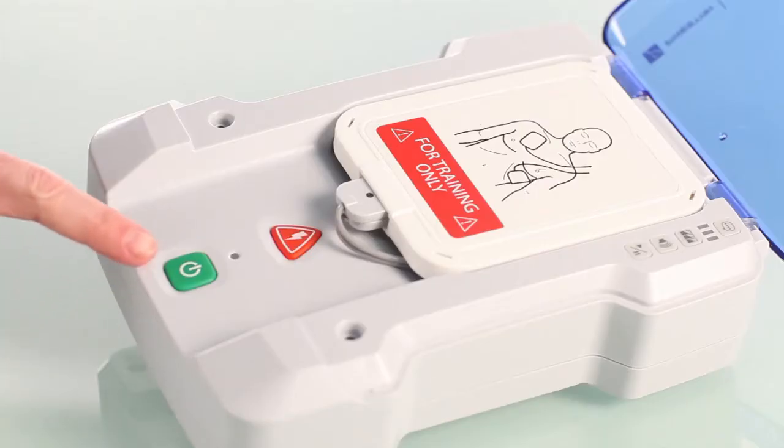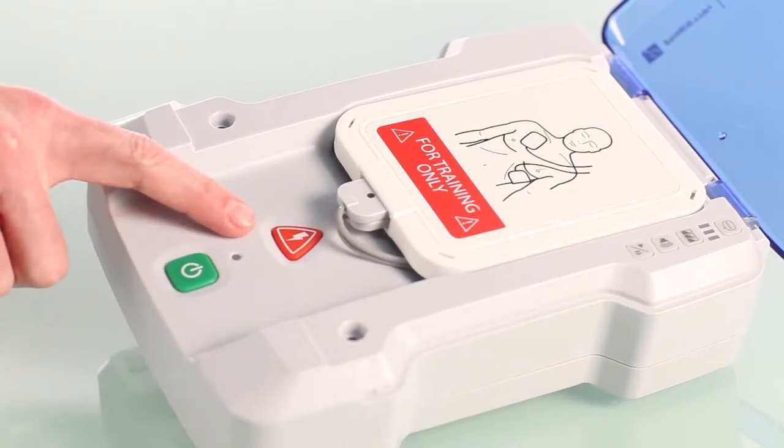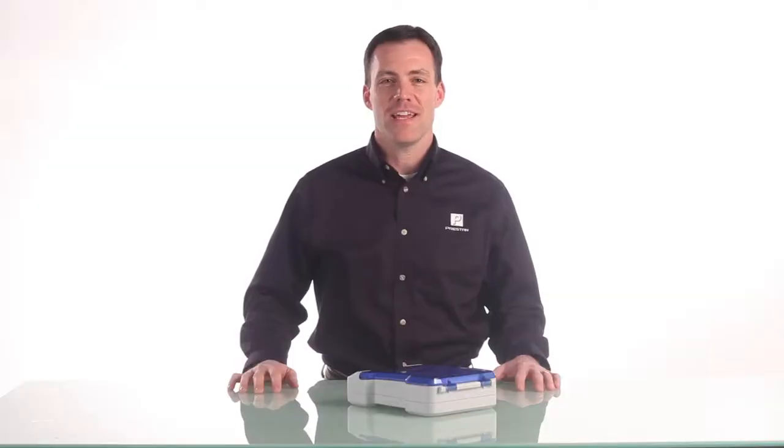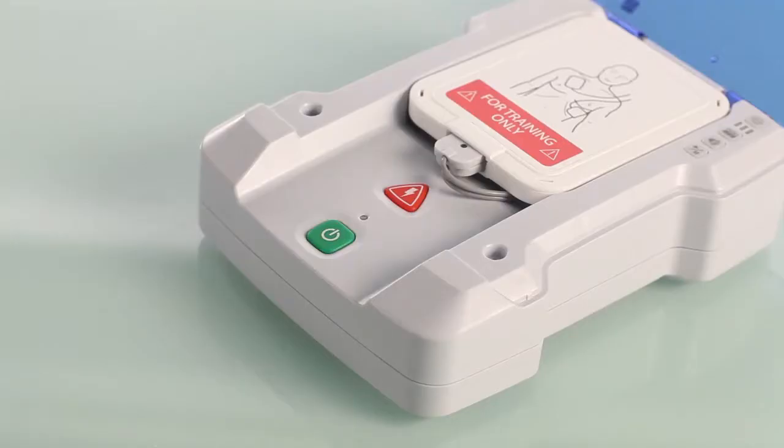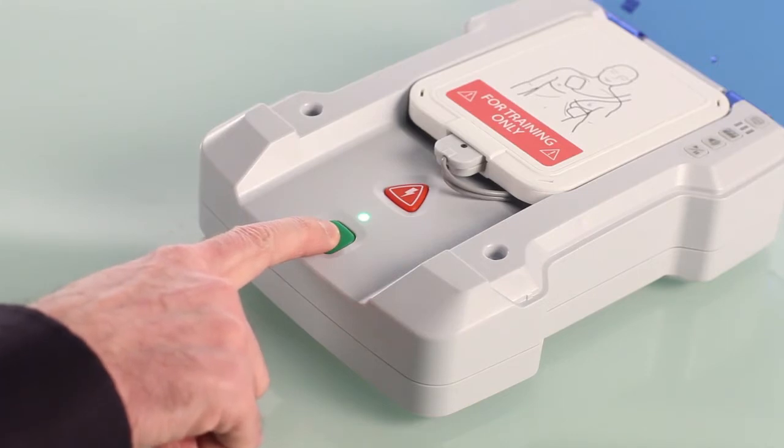The green button is the on/off button. The red triangle button is the shock button. The Preston AED trainer is preset for semi-automatic mode, which will handle the majority of your training. To change to fully automatic mode, hold down the on/off button for 10 seconds until you hear two beeps.